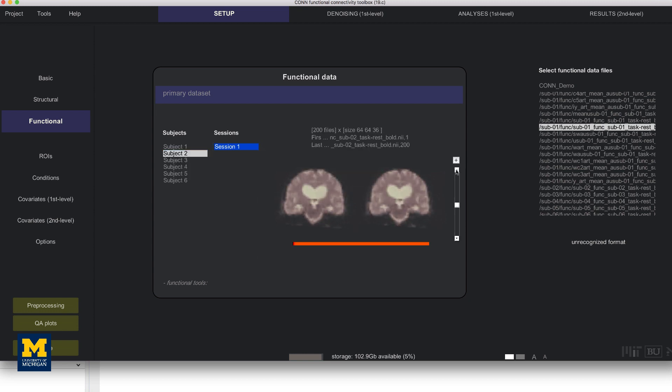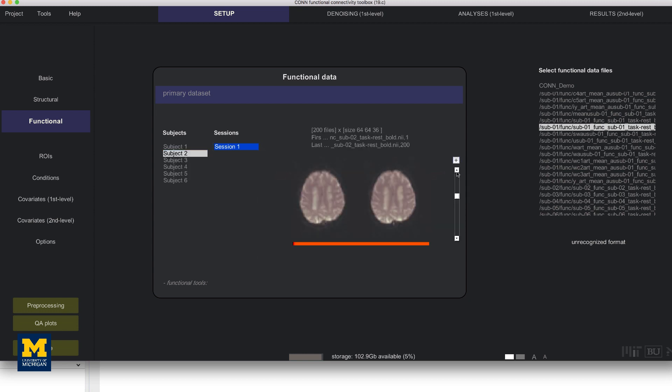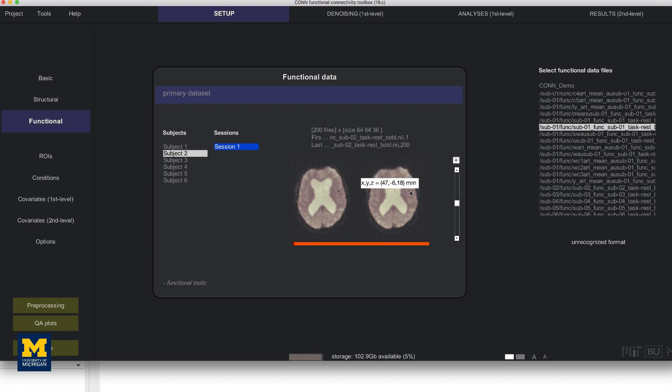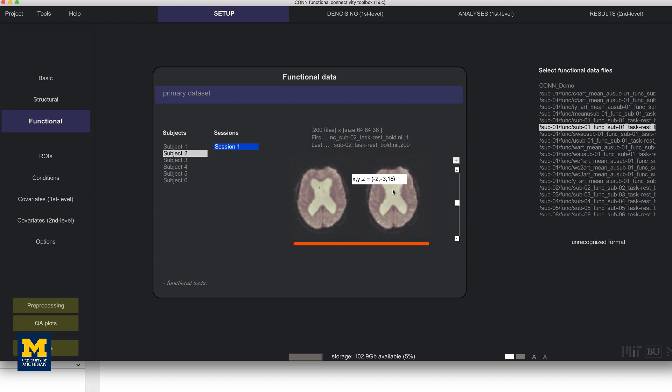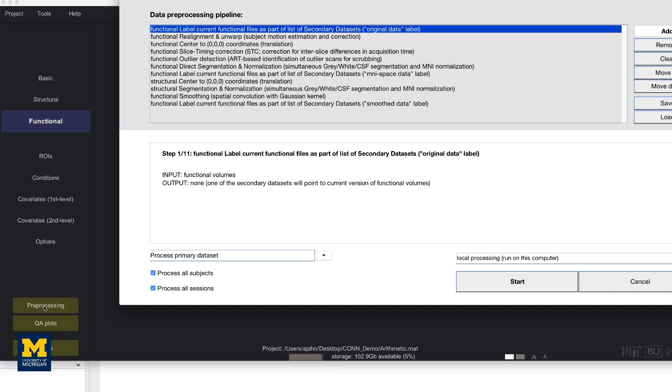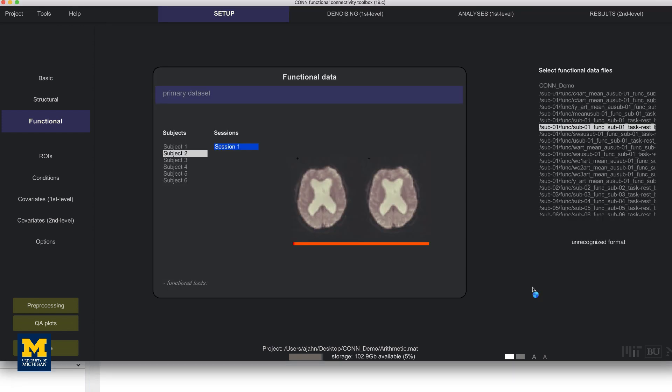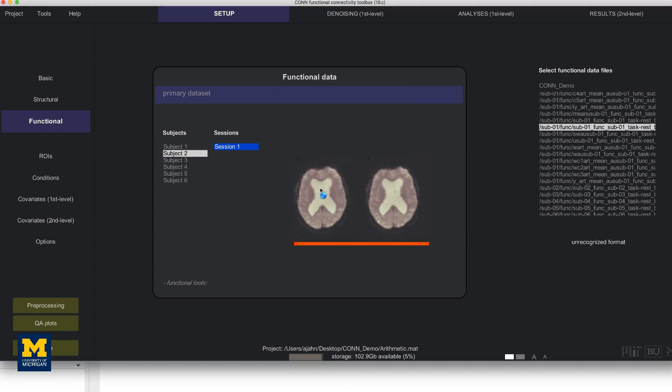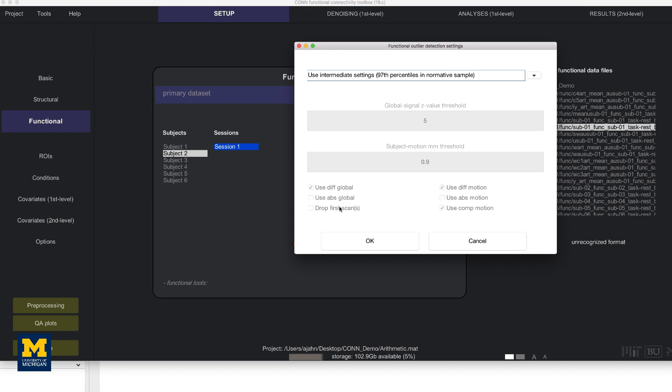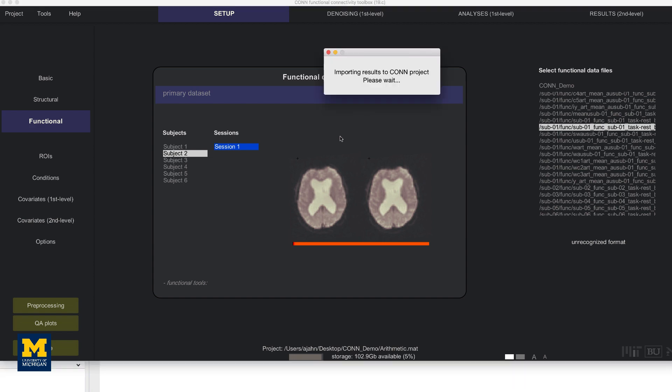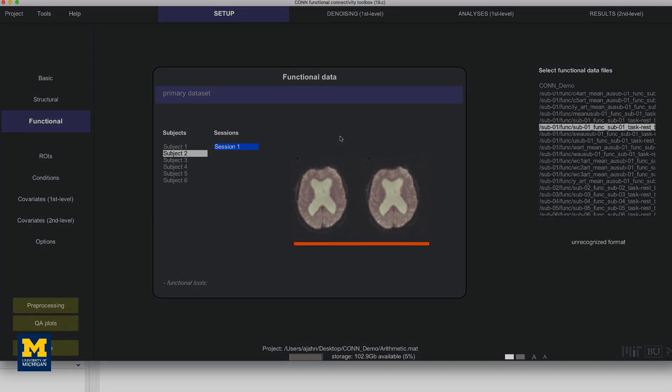Now, this guy has gigantic ventricles. Is that going to be a problem? We don't know for sure yet. We can still probably segment the gray matter without any problems, but I would definitely keep an eye on this and see whether any of the estimates turn out to be outliers because the ventricles may have some kind of indirect effect on that. Now, click the preprocessing button to begin preprocessing all the subjects in a single batch. This will take about five to six minutes per subject or about 30 minutes total. We're going to fade out now and come back when it has finished.